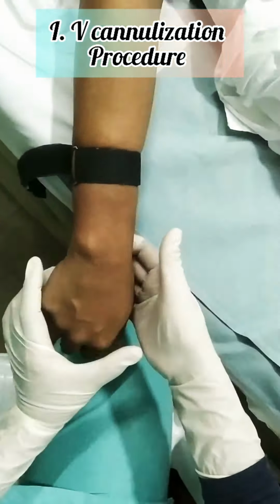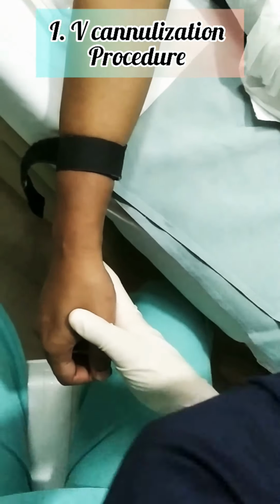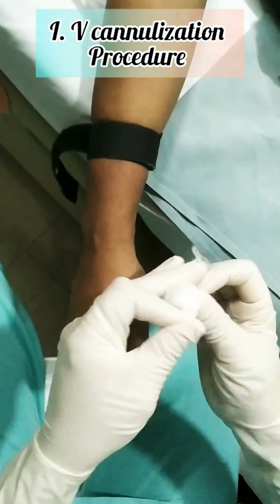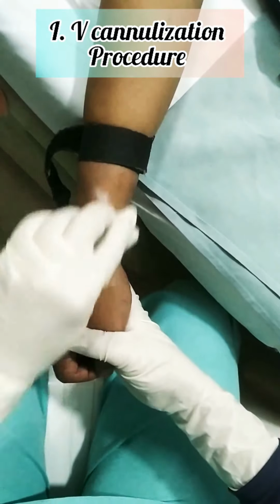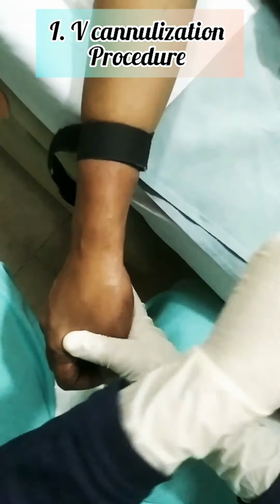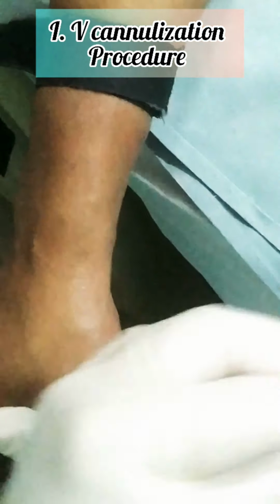Then after that we have to assess the area where we want to do the IV cannulization and tie the tourniquet to the selected area. Basically, a tourniquet does two things. First, it stops the blood flow and makes the vein palpable, prominent and visible to the naked eye. Second, the vein will not slip or move while inserting the IV cannula.